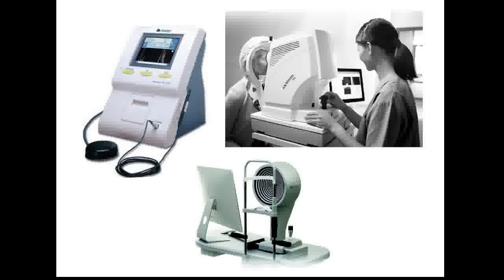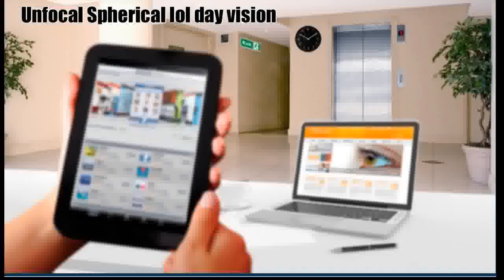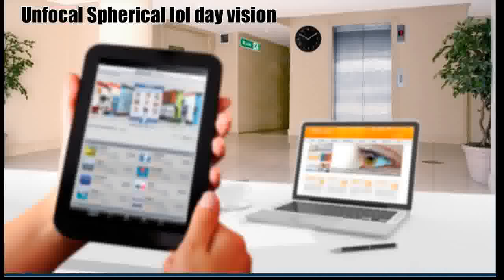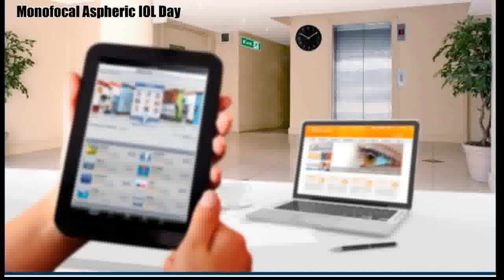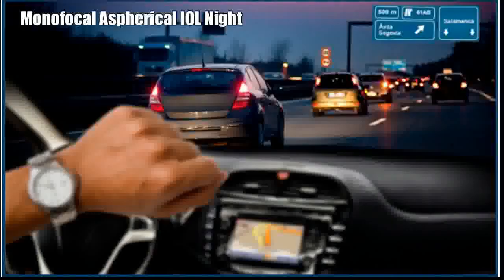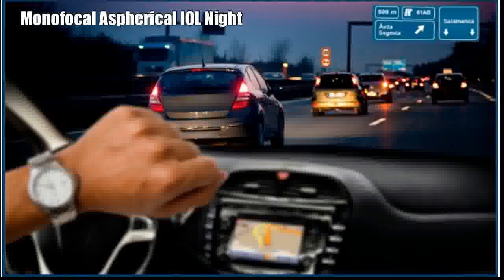But as the lens ages and becomes hard, more energy is required to break the lens, and this energy generates heat and can be harmful to eyes. Coming to different types of lenses, there are three basic types. Monofocal lenses — these intraocular lenses have one focal point and are used to correct distance vision. The patient is required to wear glasses for near and intermediate work after surgery. There are two types of monofocal lenses: spherical intraocular lenses and aspherical intraocular lenses. One may not find significant differences between the two lenses in daytime vision, but at night, one may find better contrast with the aspherical IOL.